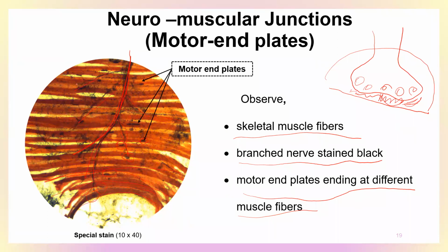The end of each of these nerve fibers grows into a small button-like area at this end, and those are the ones that are seen there. So actually seeing it, it will look like this, and there will be tiny dot-like things. You won't be able to see this membrane here.